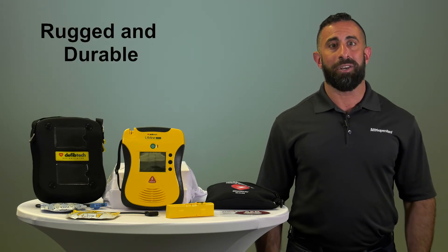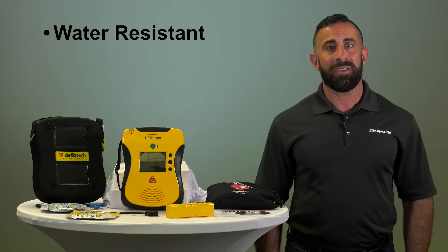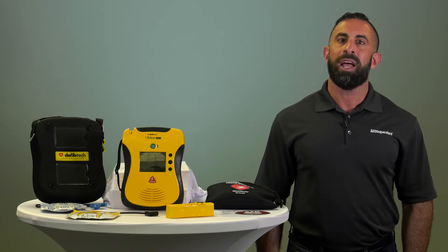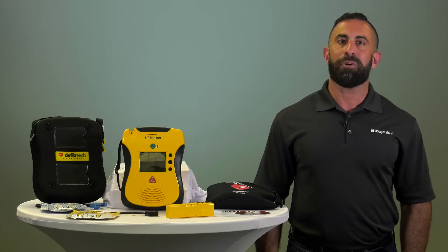This device is very rugged and durable. It is water-resistant, dust-resistant, crush-resistant up to 1,000 pounds, and suitable for use in high-vibration settings including jet aircraft, helicopters, and boats.